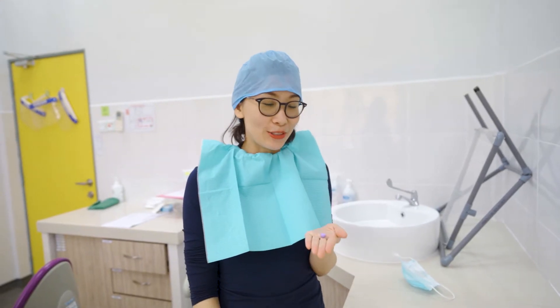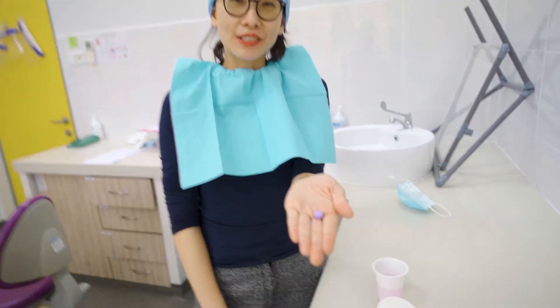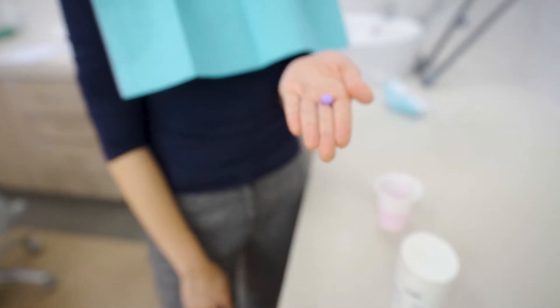Hello, I'm Victor Alice here. Today I'm going to show you a plaque-disclosing agent and how I'm going to remove it.